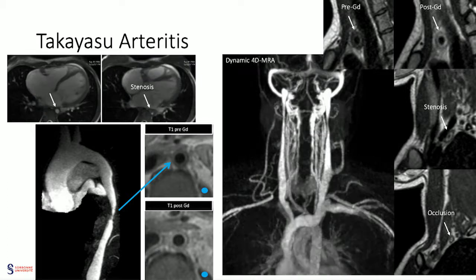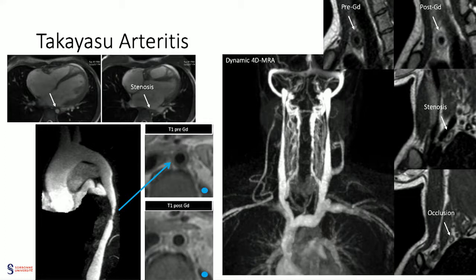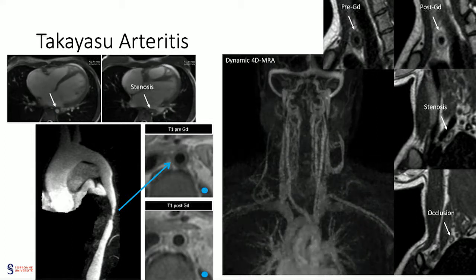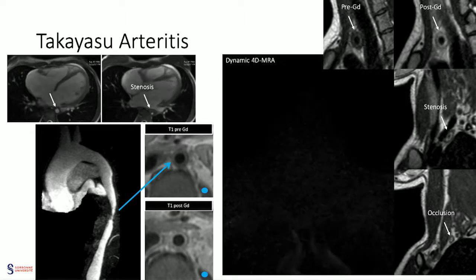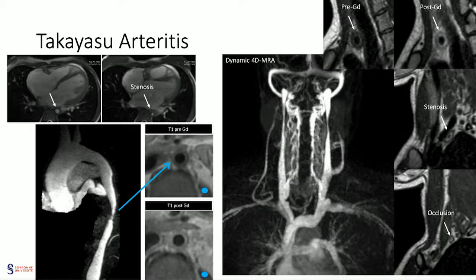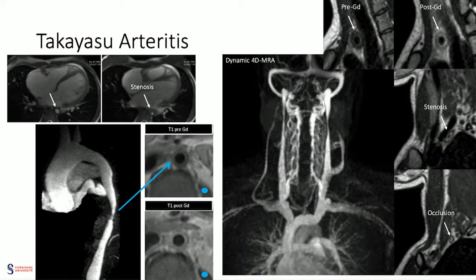So I will conclude on these images showing the very important role of MRA in the thoracic aorta. It's very difficult to assess completely, if not impossible, by echo. And of course, it's a non-invasive method of choice to follow up patients, even after surgery.